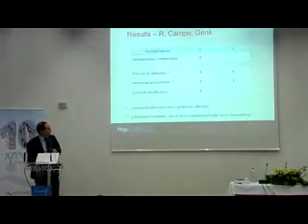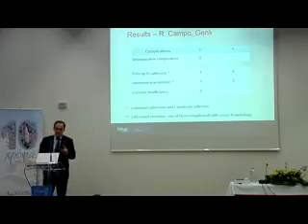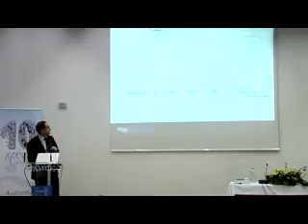Interesting. Now, what are the complications? Intraoperative, none. I'm a champ. But afterwards, we see that we have some adhesions, but they all got pregnant, but we had to treat them. And 3 abnormal placentation. Placenta retention, I do not know if there's someone here doing obstetrics, but if it starts bleeding, this is really, really heavy. So 1 patient, intensive care, and nearly died. There was one at 36 weeks. So we have to be careful, and we have to inform the obstetricians of this risk.